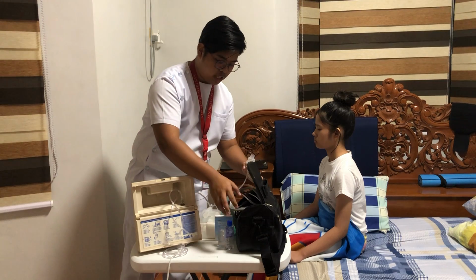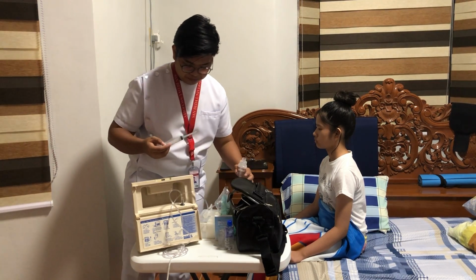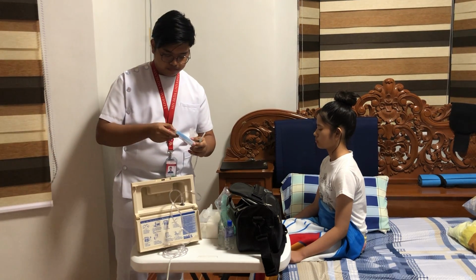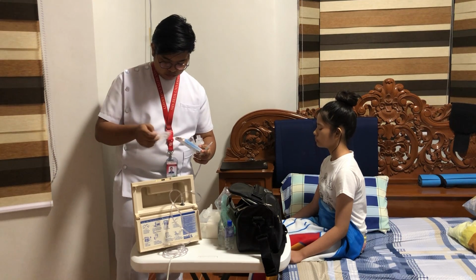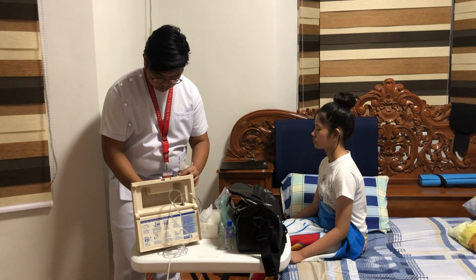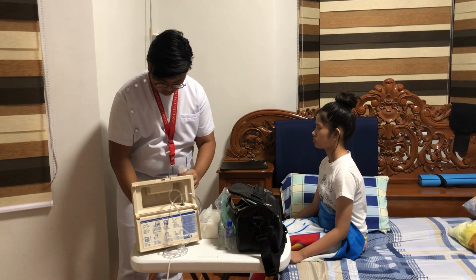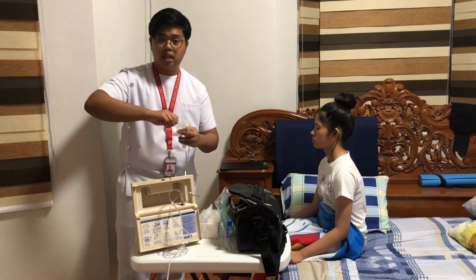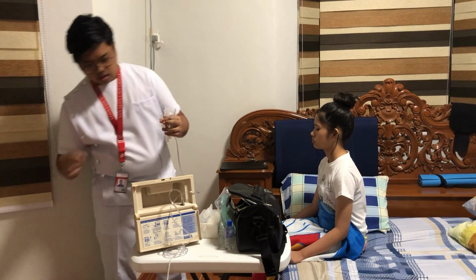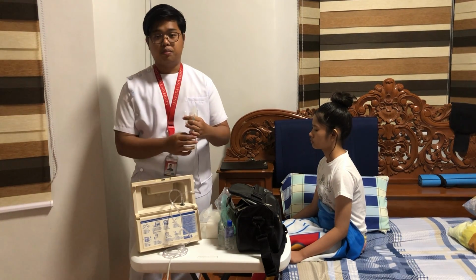So in this case, we need our syringe that I have here, and then our medication, of course. So we're going to open the nebule and then discard. Get an appropriate amount according to the doctor's prescription.